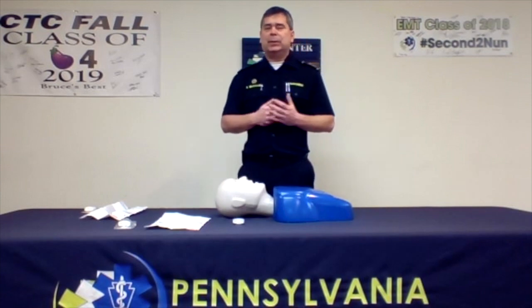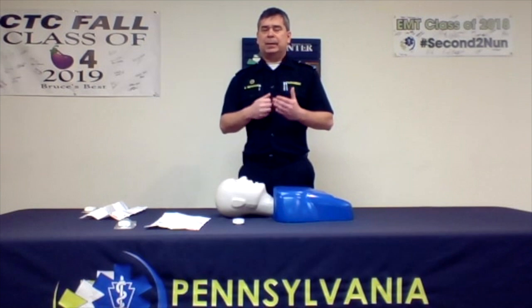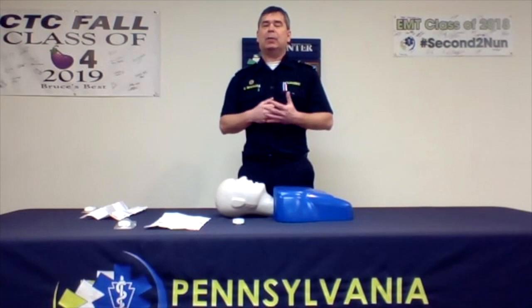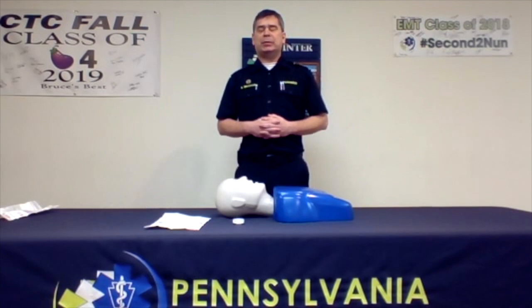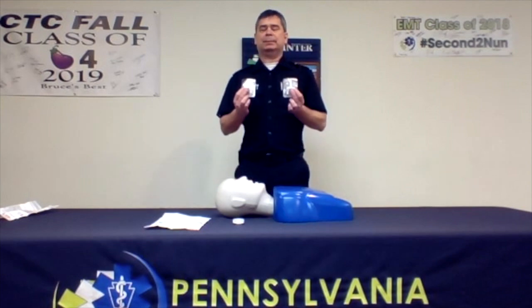Upon arrival of the ambulance, you can get additional Narcan given to you by the EMS crew while they're on scene. This is called the Leave Behind program. It will allow you to retain a dose of Narcan for your loved one or family should you need it in the future. Each emergency Narcan kit will come with 2 doses of Narcan.